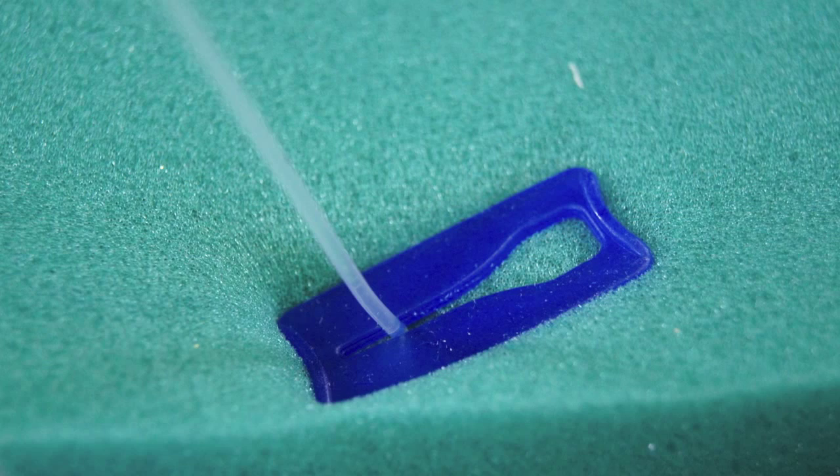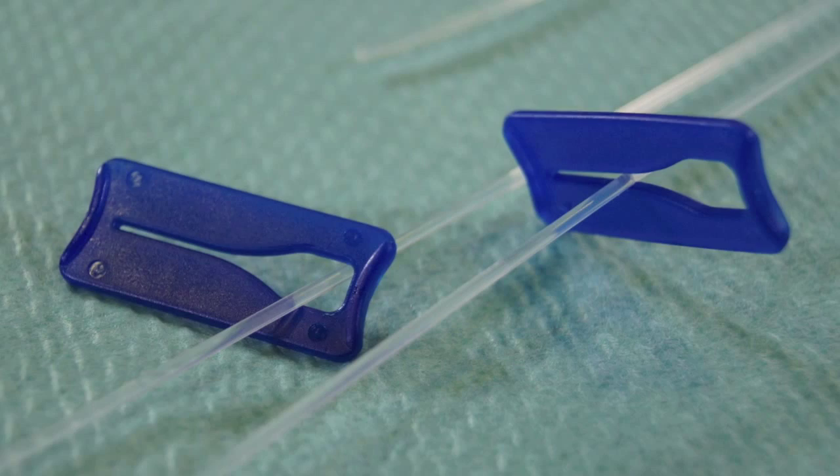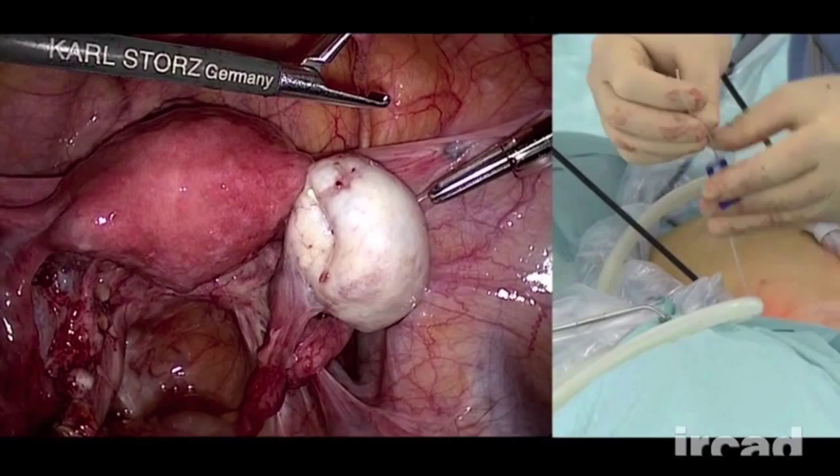As the system is easy to unlock, tension can be adjusted according to the steps of the surgery. Traction can be distributed along the two arms of the device, allowing to exert more tension on the tissue. This is known as the T-shape configuration.